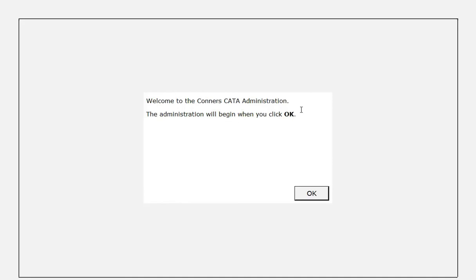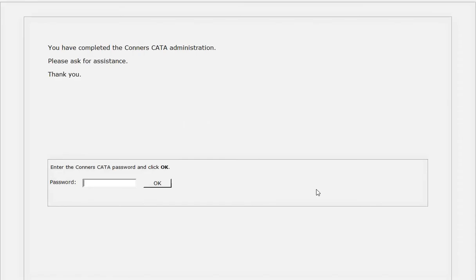Welcome to the Connors CATA administration. The administration will begin when you click OK. Once the administration is completed, the program advises the respondent that they have completed the assessment and to please ask for assistance. The administrator then enters a password to proceed back to the Connors CATA software main menu.